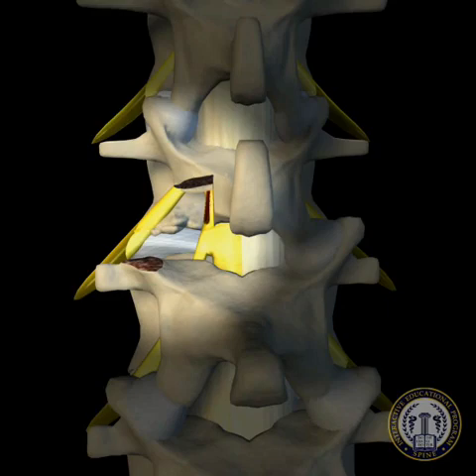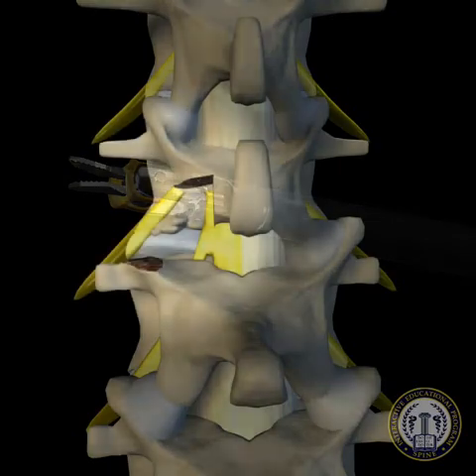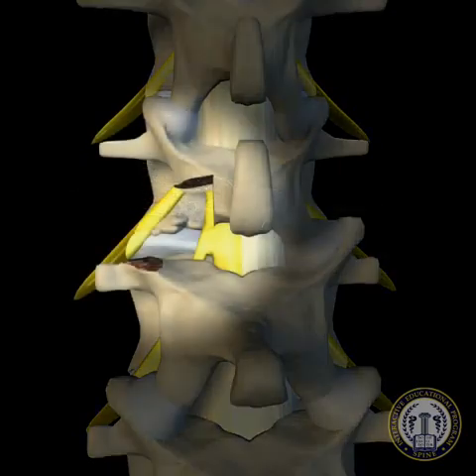Epidural bleeding frequently occurs during this step of the procedure and may be controlled using bipolar cautery and thrombin-soaked gel foam. Though it is unnecessary to expose the entire exiting nerve root, it is important to be aware of both the root's location underneath the superior pedicle and the amount of space between the medial edge of the exiting nerve root and the lateral margin of the traversing root.